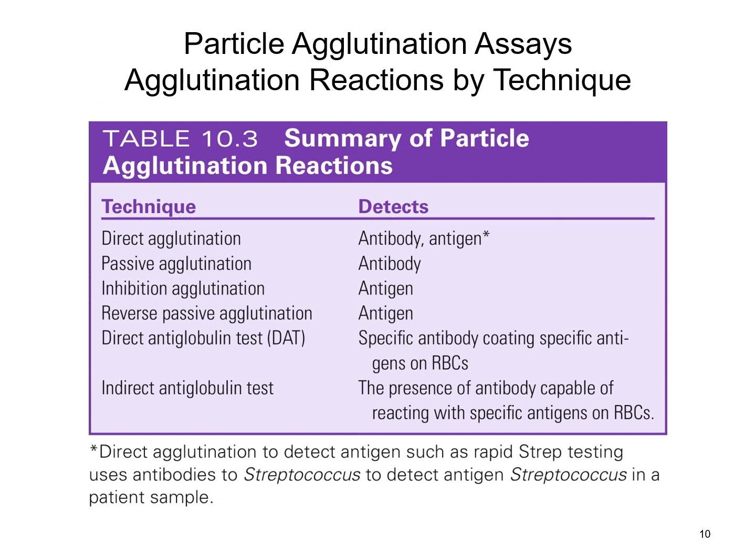There are also different techniques that are used with some of these different test kits and test methods. Some examples would be direct agglutination, in which you're directly trying to detect the particular antigen that's present or antibody that's present. An example of this would be a rapid strep kit, where you're looking for the presence of the streptococcus antigen in the patient. If you suspect a patient has strep throat, you do the swab and you do the test. You're looking for that bacterial antigen to be present in that sample.